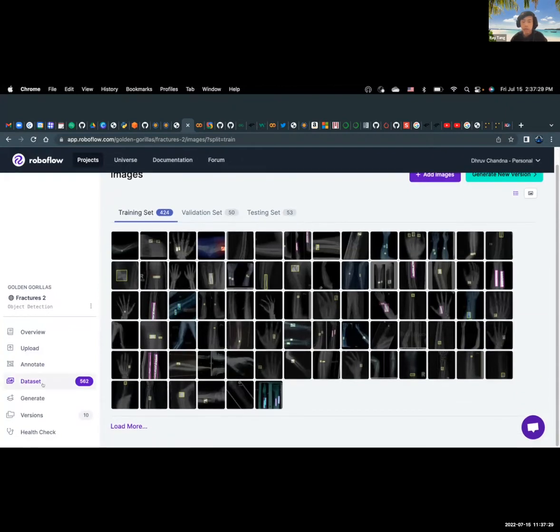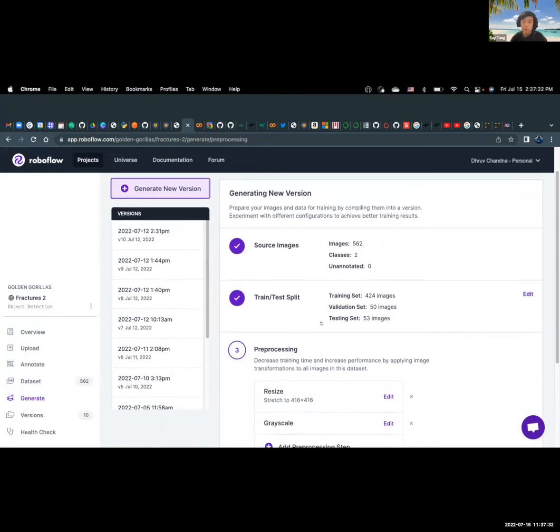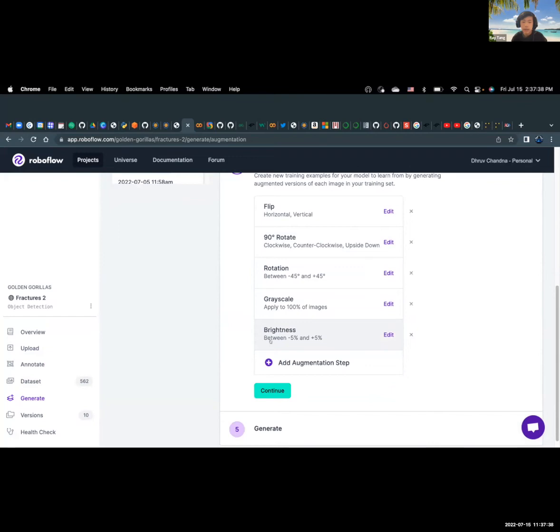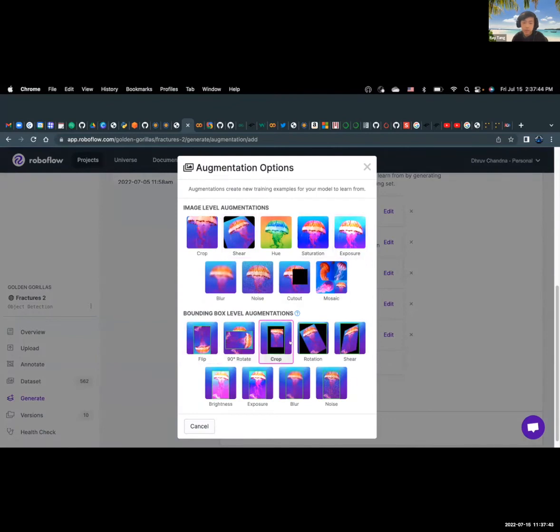Data augmentation is basically a way to generate more data using existing data. You can add a bunch of attributes, which Dhruv is showing right now. You can add flips, rotations, horizontal translations, and most importantly, blur and noise, because some of our x-rays were really bad quality. This also increases the quality of the data in a sense, because now we have a wider range of data to train our model with. And if you put in good data, you'll get a good AI out. So data is a really important step in it. And I'll pass it back to Lalita.